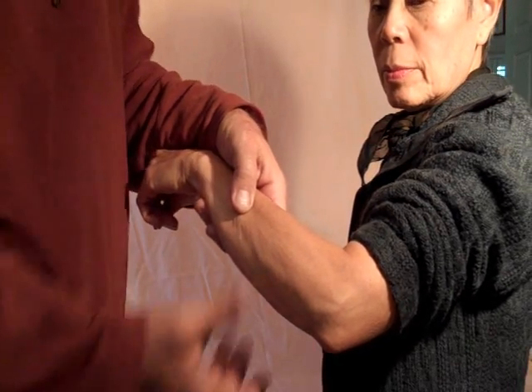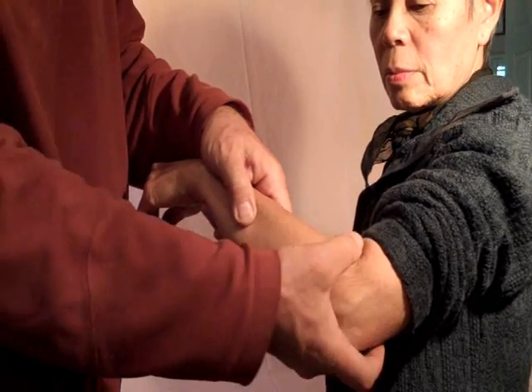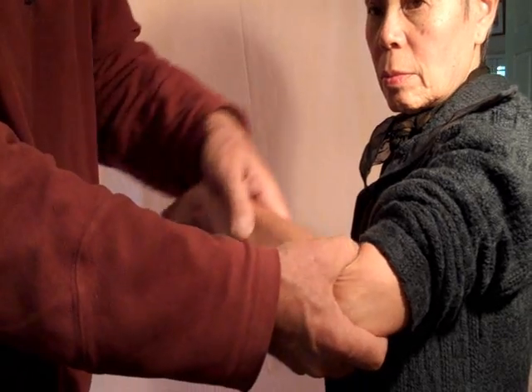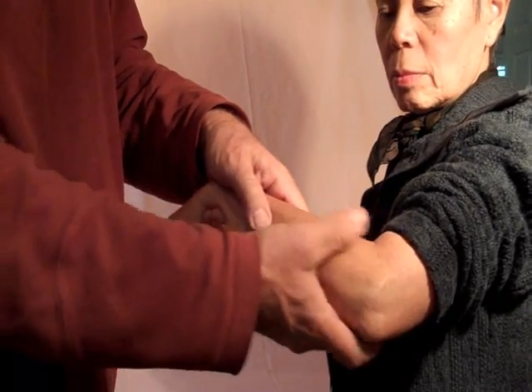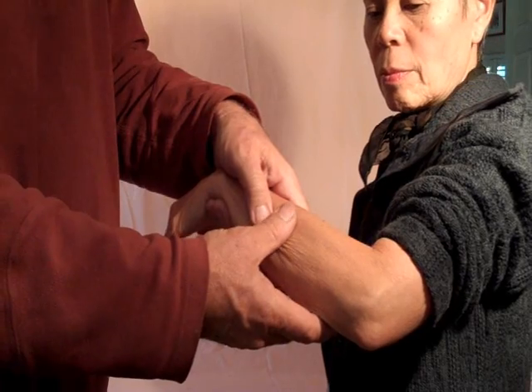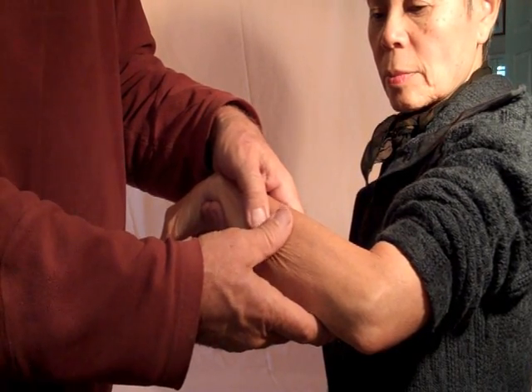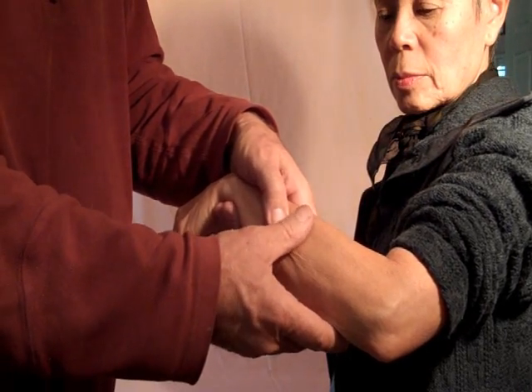While I'm doing that, I'm checking the residual limb — the arm — to see if it's flexible, if the joint has frozen up for any reason, as that makes it difficult to use the prosthetic. I'm also testing the muscles to see if there's any tenderness, wounds, or sores that haven't healed, because both of those make it difficult to use a prosthetic, and the person should wait until they heal and come back for a fitting at a future time.